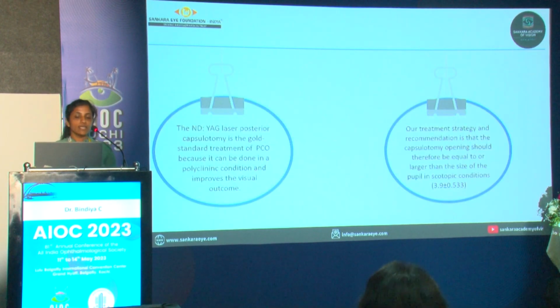So thus concluding that laser capsulotomy is the gold standard treatment for PCO because it can be done in a polyclinic condition and improves the visual outcome. Our treatment strategy and recommendation is that the opening should be larger than the size of pupil in scotopic conditions.